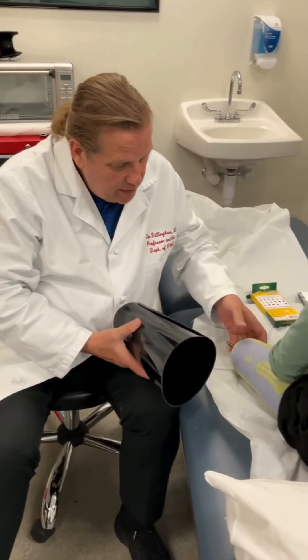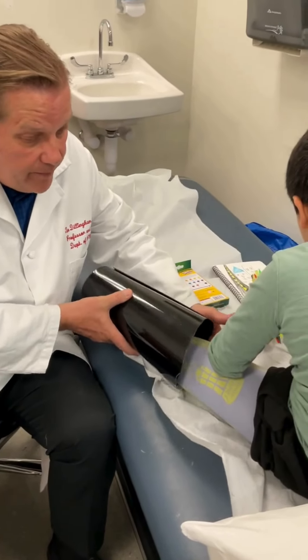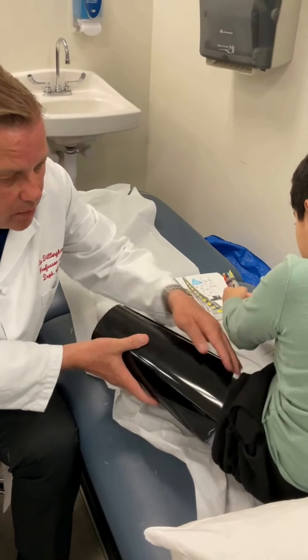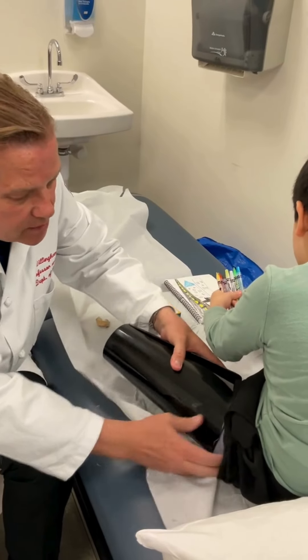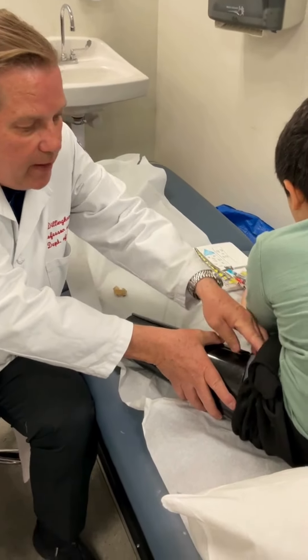Bring your leg out here, Jayden, a little bit if you would. You're going to cut the length. Can you lift up your arm, please? A little bit? There we go. So you know you've cut it approximately like this, and you see it's about that long.